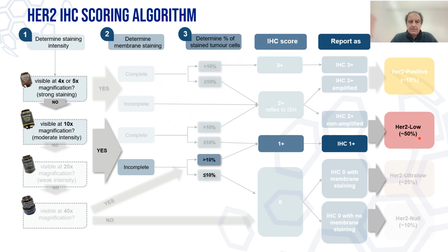And this is a quick guide to the interpretation algorithm.